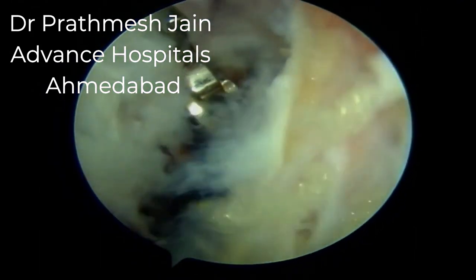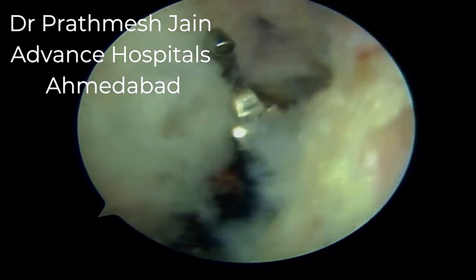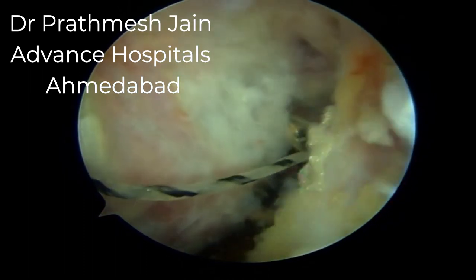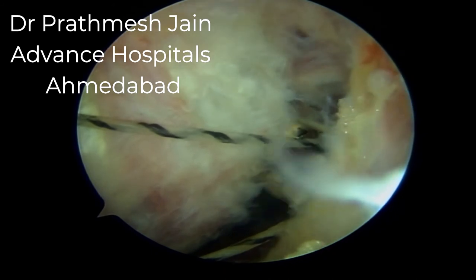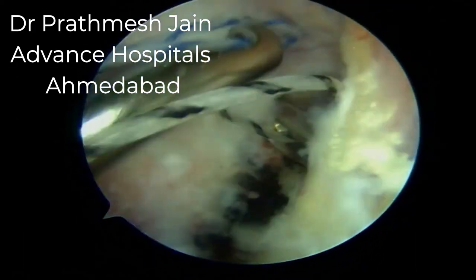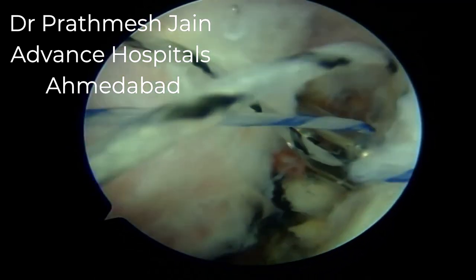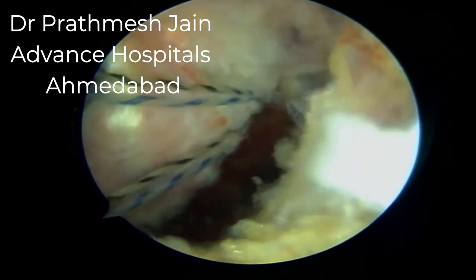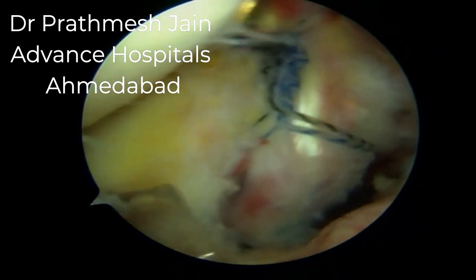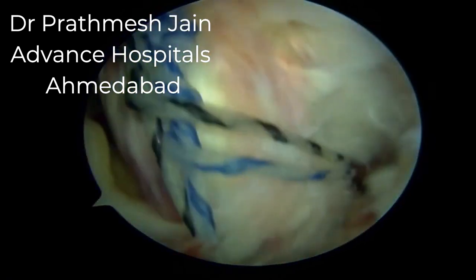After passing the drill through the lateral tunnel, we use the suture retriever to retrieve the remaining two suture limbs — the blue and black — sequentially into the retriever and pull them from the lateral tunnel. There are two tunnels in this technique. A key advantage is that this is an implantless technique: no screw, no buttons, nothing — only fiber wire sutures are used to repair the construct.